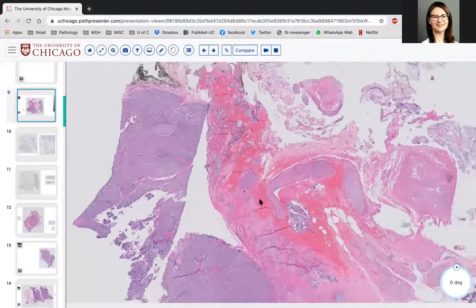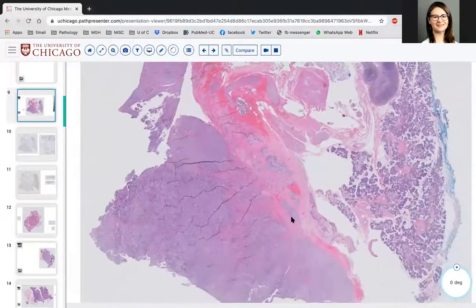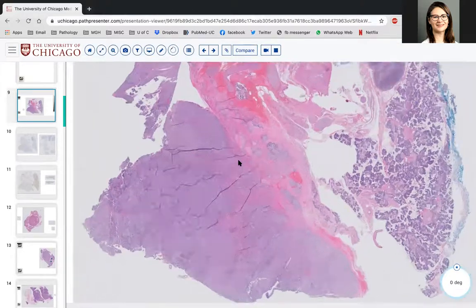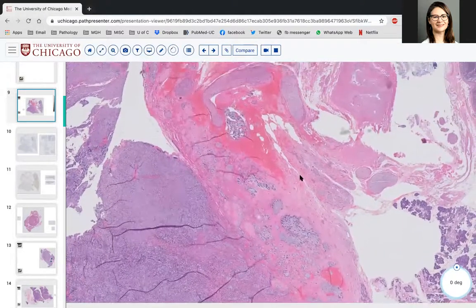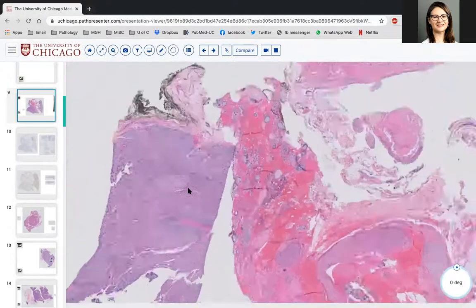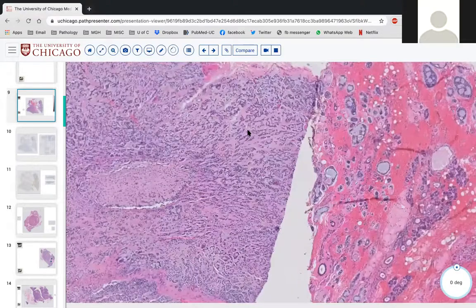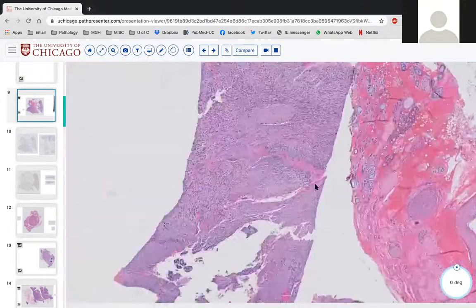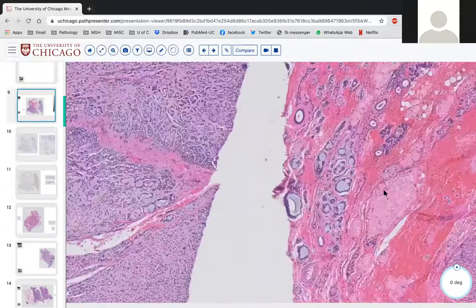Like, could this be a PA? Sure. Could this be an adenoid cystic? Sure. She's got jaw discomfort. It doesn't say nerve pain, but nerve pain could also help you very much to point it more towards an adenoid cystic. So yeah, so here's a resection. Yeah, it doesn't seem as well circumscribed. I mean, I guess this looks more adenoid cystic now, looking at this resection.